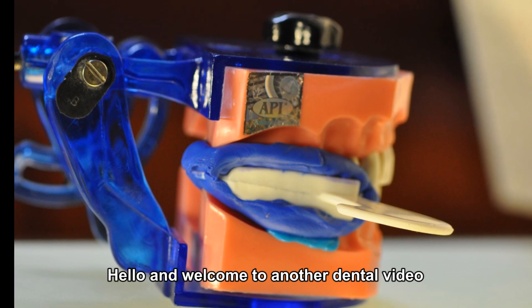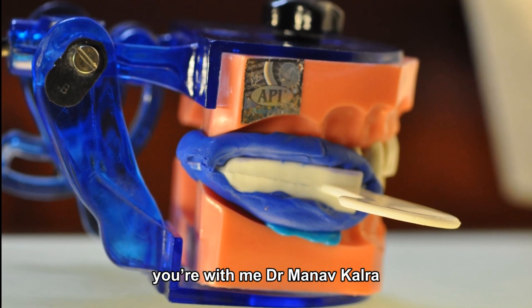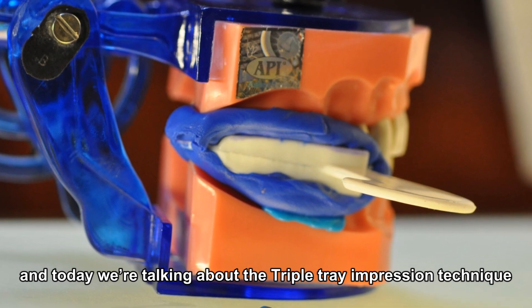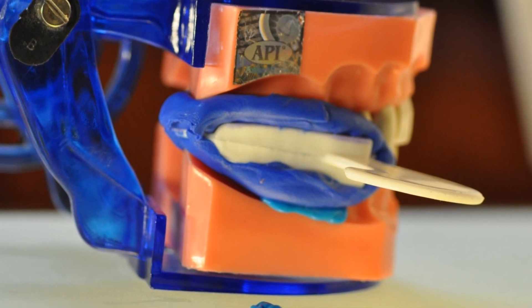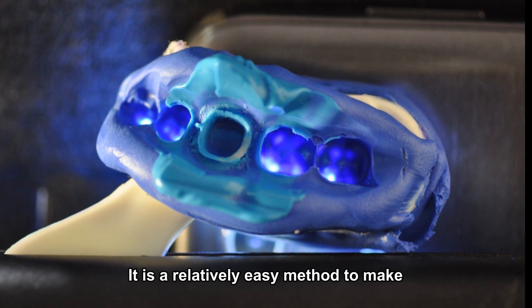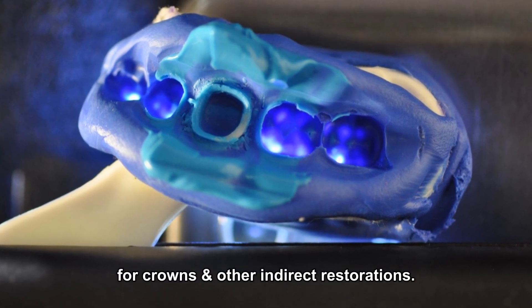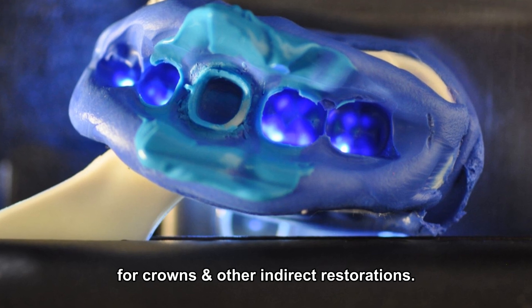Hello and welcome to another dental video. You're with me Dr. Manav Kalra, and today we're talking about the triple tray impression technique. It's a relatively easy method to make accurate impressions for one or two units for crowns and other indirect restorations.